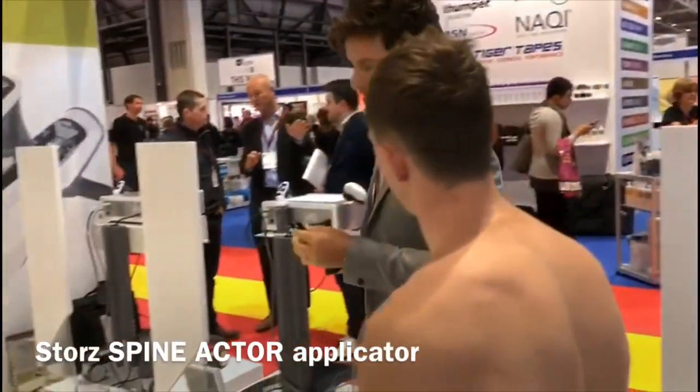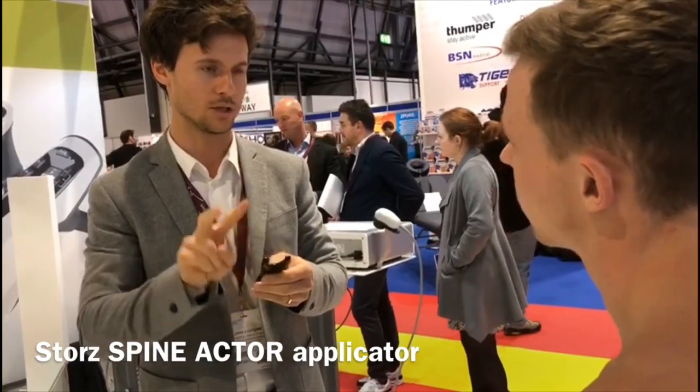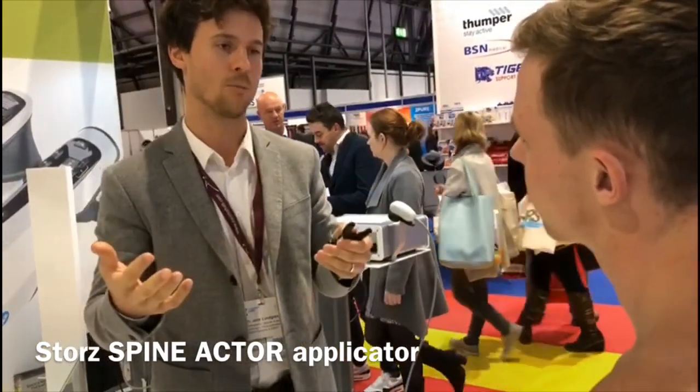SPINE-ACTOR. So this is actually aiming towards the joint. You can use it to mobilize the joints. Yeah. You can also use it to treat the muscles on each side of the spine. But I will use it to mobilize the joints. And this should be pain-free, almost.